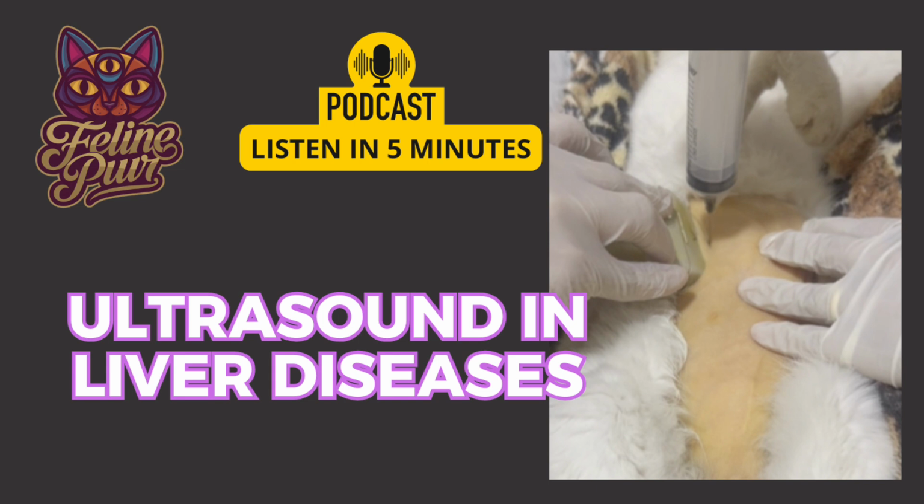or focal changes. Liver size is a subjective assessment based on the operator's experience. An enlarged liver, or hepatomegaly, may have rounded lobes and blunt edges. In a lateral view, a large liver may more completely surround the right kidney. On the other hand, a small liver may make the gallbladder appear to occupy a large portion of the hepatic space. The echogenicity of the liver in cats requires special attention.